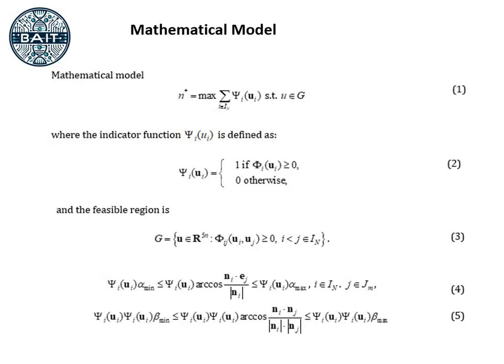In the model, each capsule is represented as a composite object, a cylinder and a sphere. This structure allows simultaneous control over both geometric feasibility and dosimetric safety. The tumor region is modeled as a convex polyhedron, and the goal is to place as many capsules as possible inside this region without overlapping, maintaining a safe minimum distance between capsules and the boundaries of the target.